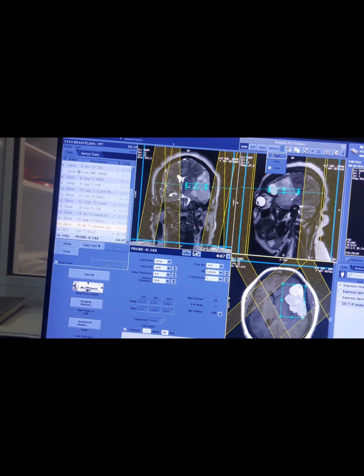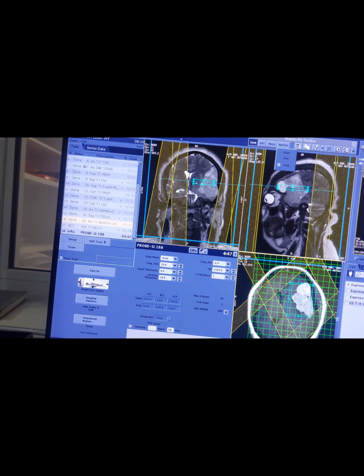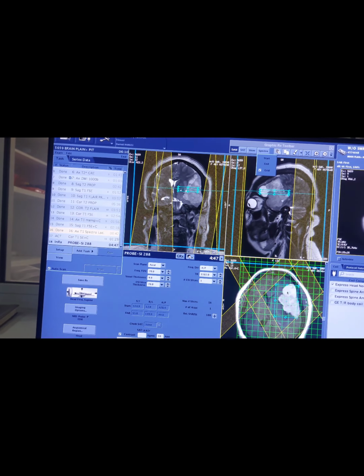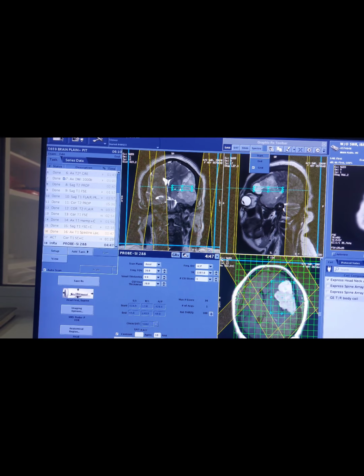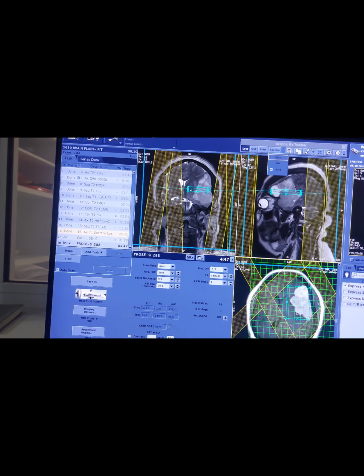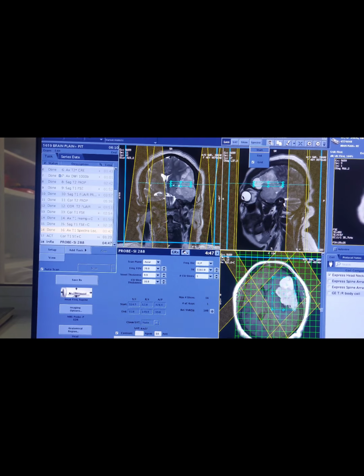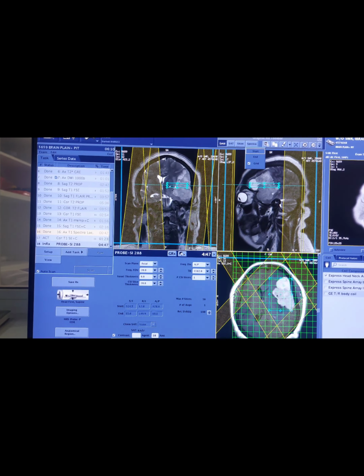Then here we can apply spectro. This is the grid. We will apply the grid in such a way that the spectro box contains complete boxes of the grid. These green boxes are for the grid, and the single blue box will cover the whole boxes of the grid. If the boxes are complete like these inside, then we can get the ratios and values of chemicals for these boxes.